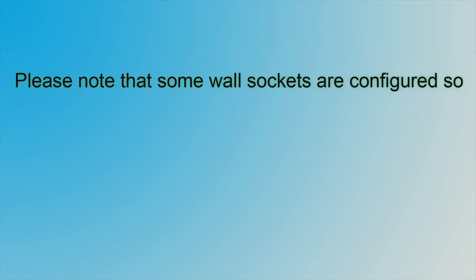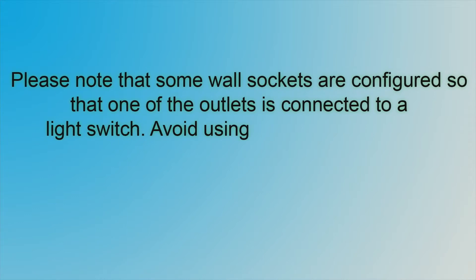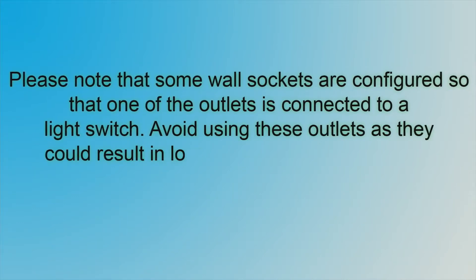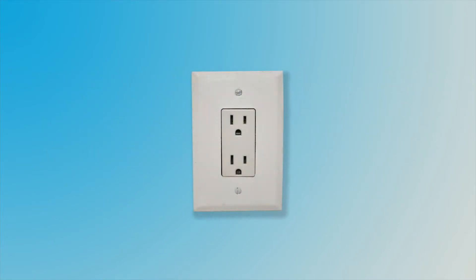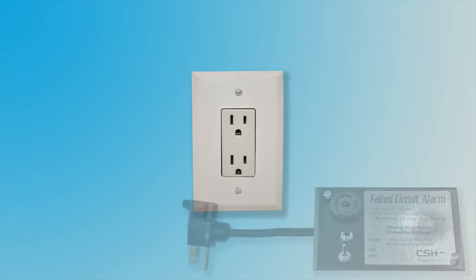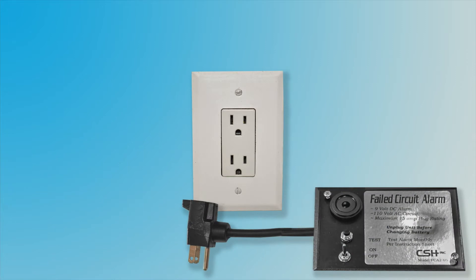Now it is time to connect the compressors to the electrical outlet. Please note that some wall sockets are configured so that one of the outlets is connected to a light switch. Avoid using these outlets as they could result in loss of airflow to your chamber. The following diagrams will describe several options for connecting your compressors to the electrical outlet. First, install the 9-volt battery that was included in your packet into the circuit alarm. Plug the circuit alarm into the power outlet.